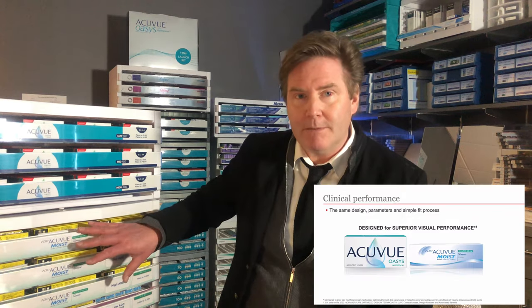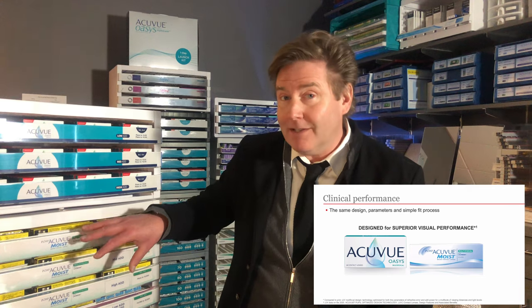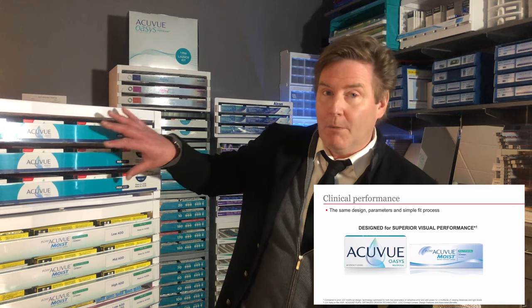Right below it is the AccuVue Moist one-day daily disposable multifocal, which has been on the market for a number of years. The design used in this lens is the exact same design used for the AccuVue two-week multifocal.